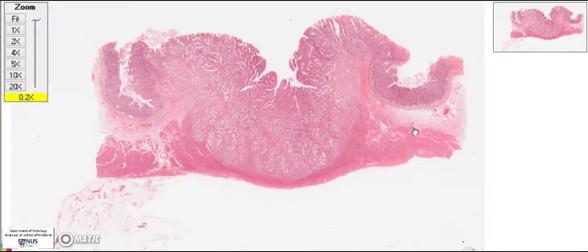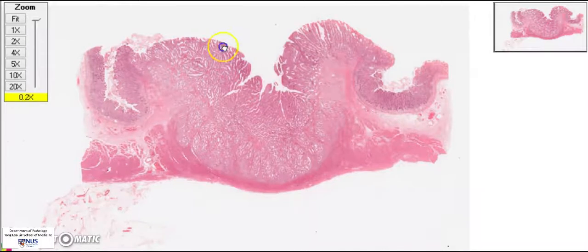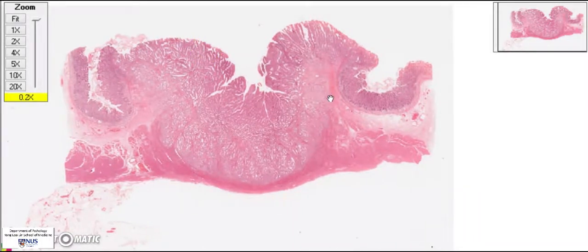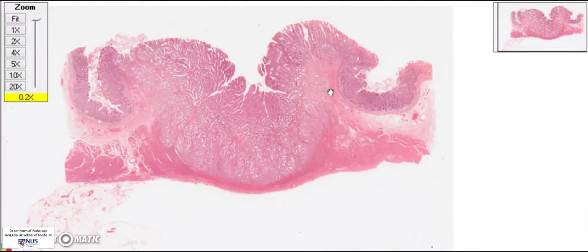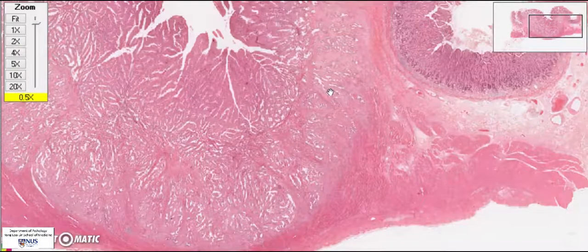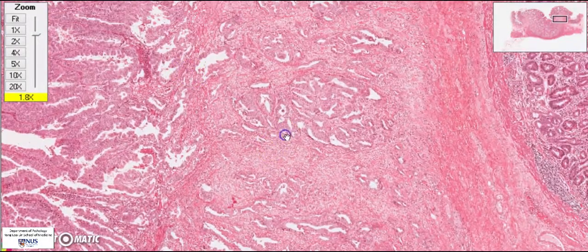The next step is to think about what important clinically significant information we can glean from looking at the microscopy of this slide. First, we want to identify the histologic type of gastric adenocarcinoma. Using the Lauren classification system, there are two main types: intestinal type, which is gland-forming, and diffuse type, which is composed mostly of single cells infiltrating the layers of the gastric wall. There is also mixed intestinal and diffuse.